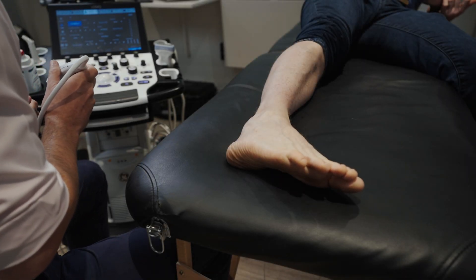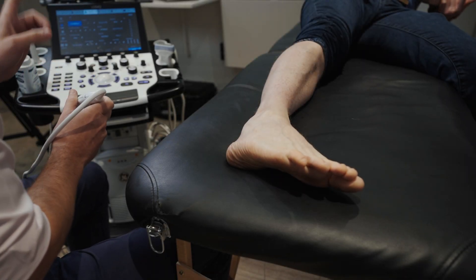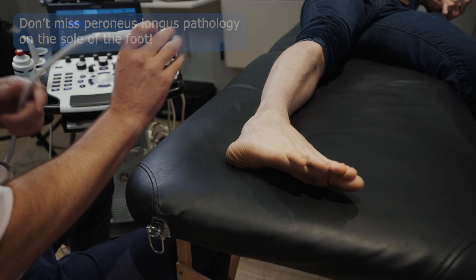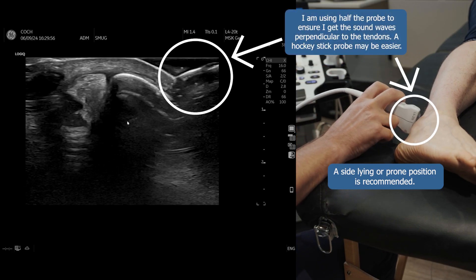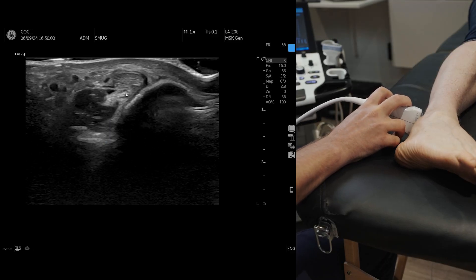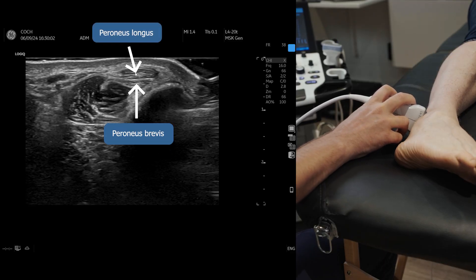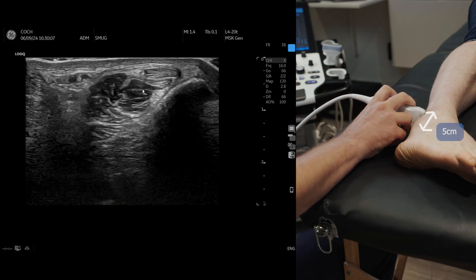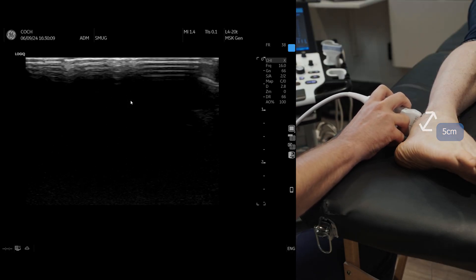I'm going to show you how to scan the peroneal tendons, but also on the bottom of the foot, which often is a missed diagnosis. First, we're going to pop the probe onto the back of the malleolus, and we can see the peroneus brevis and peroneus longus. I'm about five centimeters just proximal to the tip of the malleolus, and you can see the peroneal brevis muscle belly as we come round.